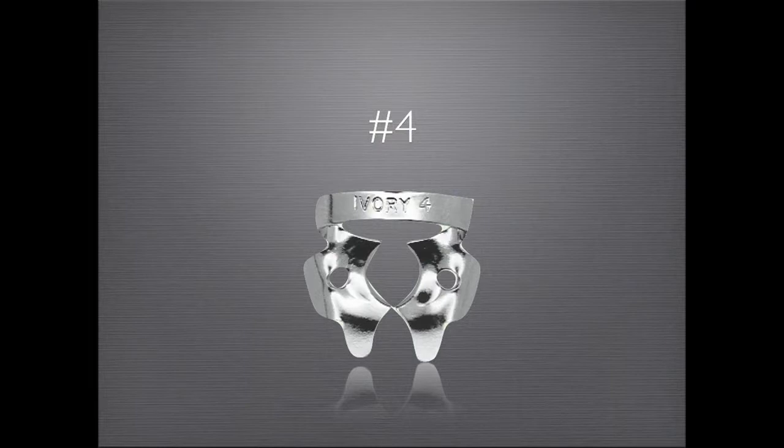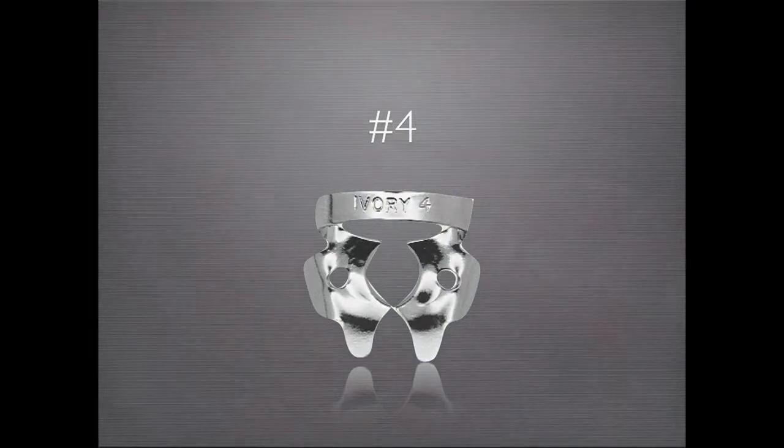The number four clamp is my clamp of choice for virtually any molar tooth. It may also be used for large bicuspids. This is an example of how I place the number four clamp.